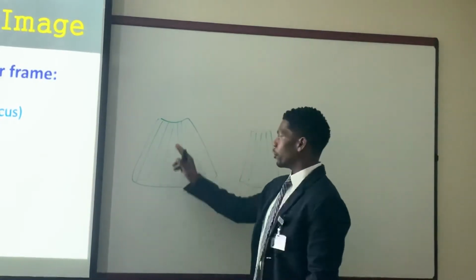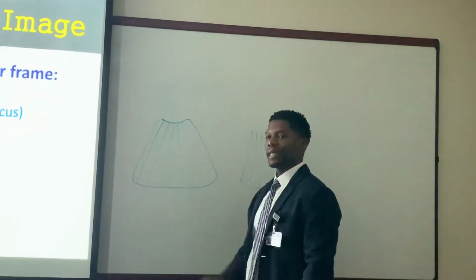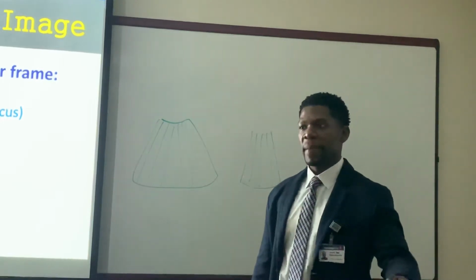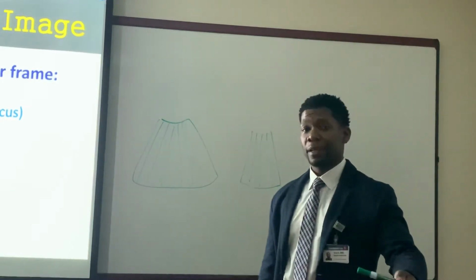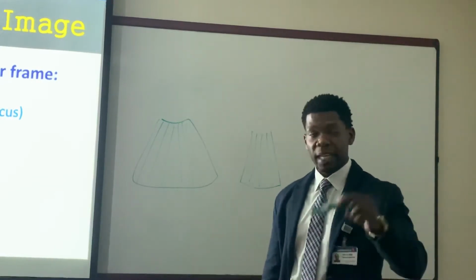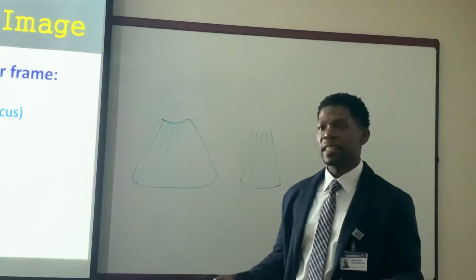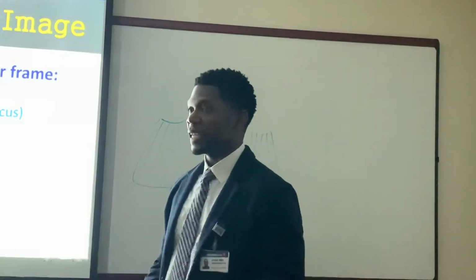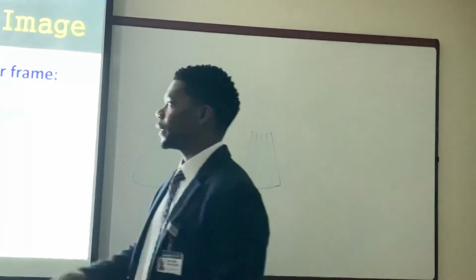Every time you have that space, that's information that possibly could be missed that the ultrasound system has to kind of make up, because we're going to talk about how we have scan lines but don't have any missing information from the image. But that's what sector line density is. Okay, so let's get deeper into them.